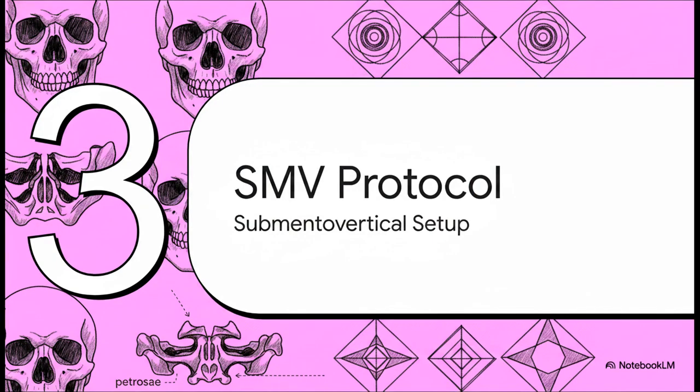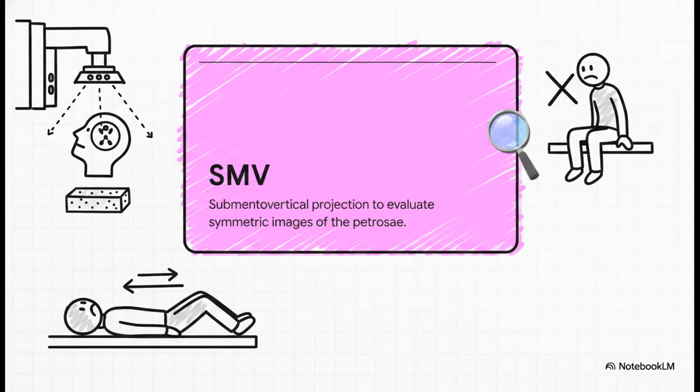Section 3, the SMV skull protocol. Let's shift gears from the occipital bone over to the submentovertical setup to evaluate the petrous pyramids. So, SMV. That stands for submentovertical.